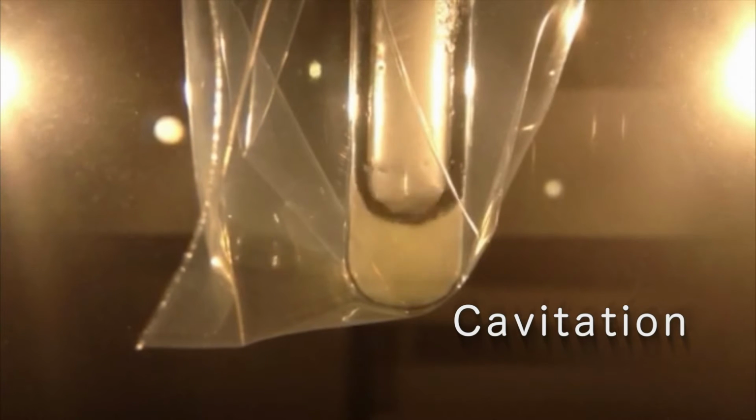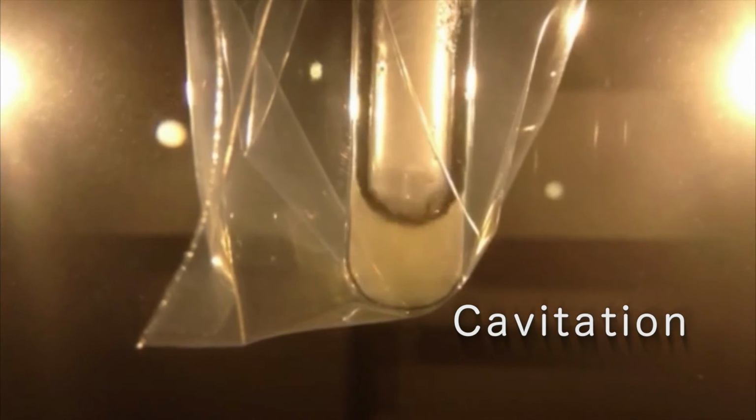What we hypothesized was that we could double the effect of HIFU by not only heating the bacteria in the abscess, but also generating intense cavitation, a one-two punch. Some heat, some cavitation to effectively kill the bacteria quickly and without pain to the patient. Cavitation, the generation of bubbles that collapse, generating high shear stresses, basically ripping the material apart next to the focus of the HIFU, and the material would be cells, and bacteria cells.